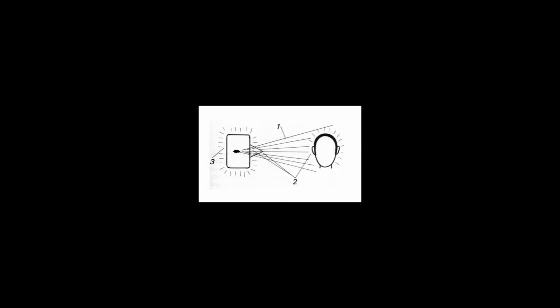Now that number 3 should be minimum or nothing, and number 2 is almost nothing, because we've got these long tubes, which are the collimator tubes, and that reduces it. And so that's fair enough, and that speaks for itself. Now, as you've got it again here, you've got the ideal focal spot as small as possible, focal spot distance to object as long as possible. The distance from object to film, I'm just going to summarize that little thing right here and put it into the slide. Okay, that should do it.